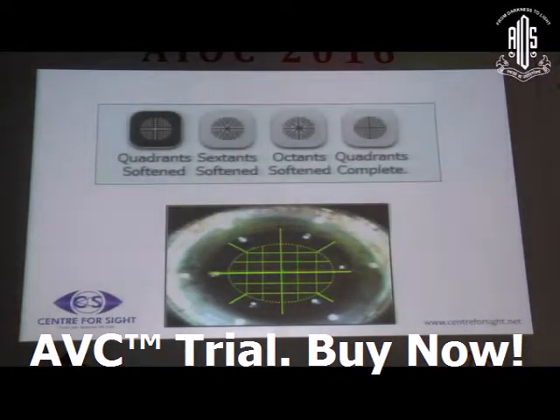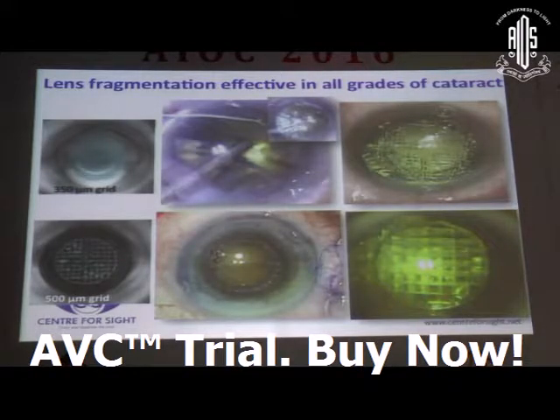Now this is the new technique, which is the matrix pattern in the Lensx machine. I have used two machines extensively, the Lensx and the Catalyst, and I did one case on the LENSAR. I haven't used the Victus. When you are looking at lens fragmentation, you can see that across all grades of cataract, and I'll be showing you some, as Dr. Keki showed you, you can fragment whether it's brown, black, or a soft cataract.